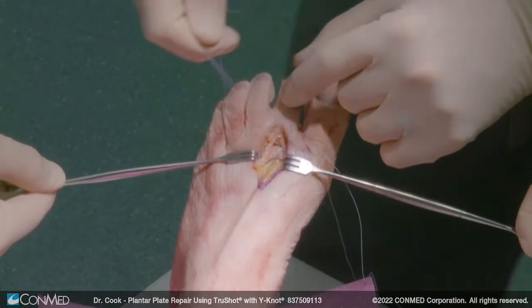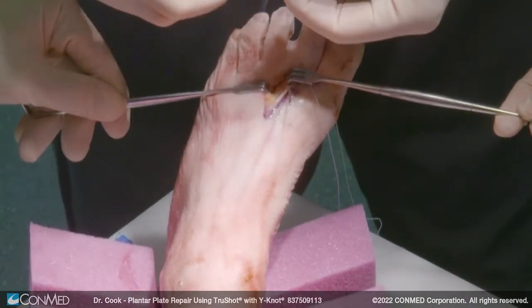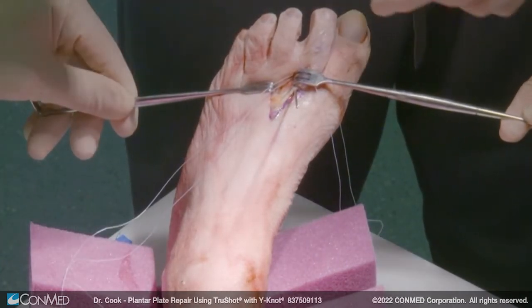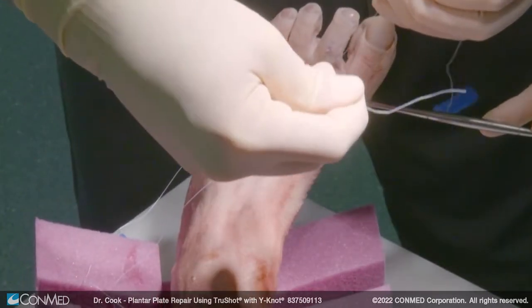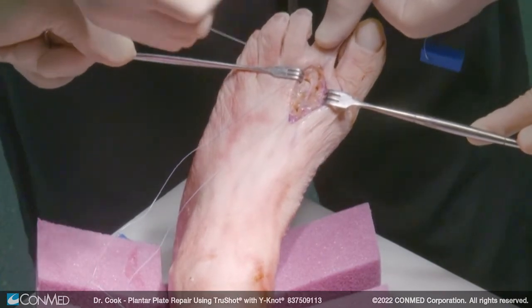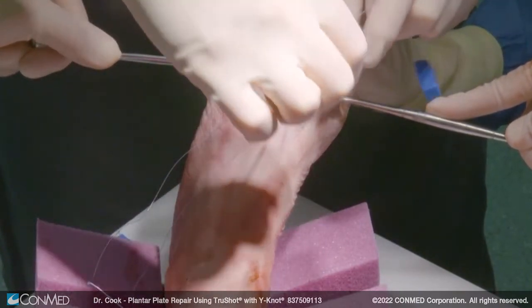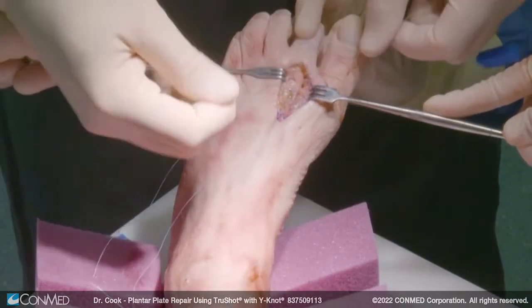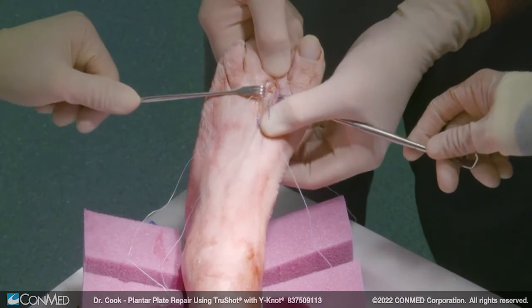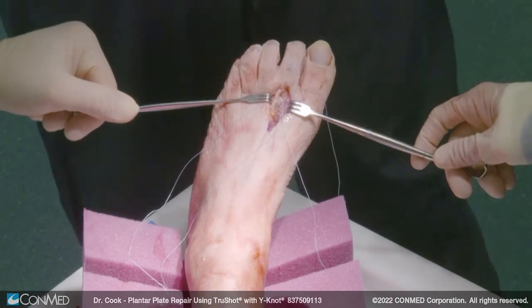I suture one side first, just tying it loosely, because if you tie it too tightly you'll start pulling your suture from the other side. Once one side is tied, we switch to the other side — this is the side we're really going to snug up. You want your assistant to hold your toe down while you do this so you know it's reduced, and you just suture that snugly, pulling all the slack out of the system. Now everything is done, and there's absolutely no instability — your plantar plate repair is finished.